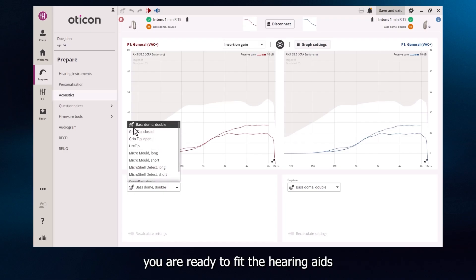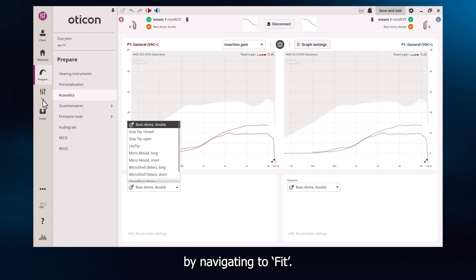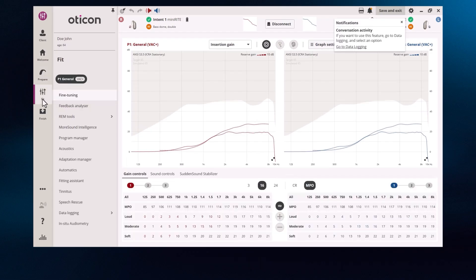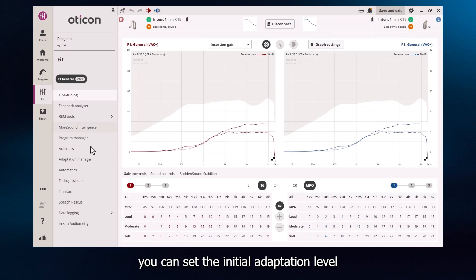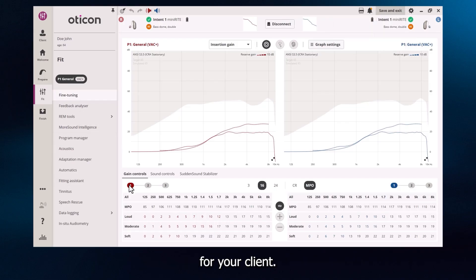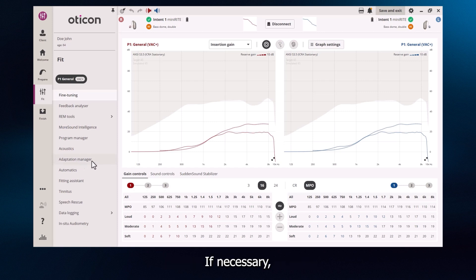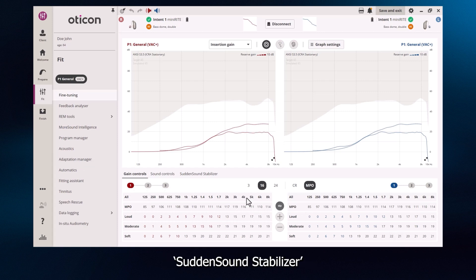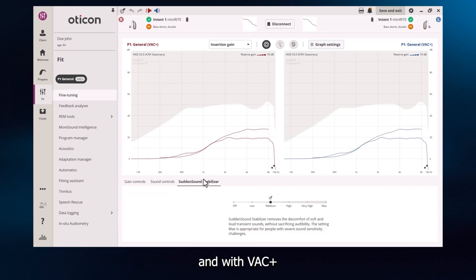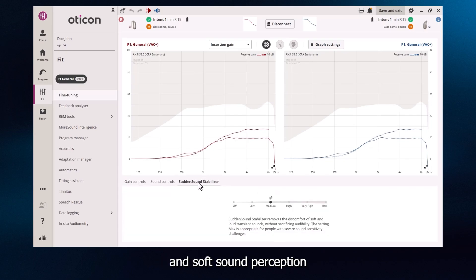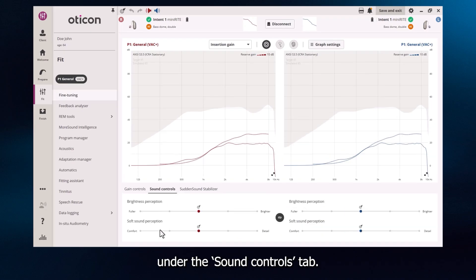After this, you are ready to fit the hearing aids by navigating to Fit. In the fine-tuning step, you can set the initial adaptation level for your client. Adjustments to adaptation time can be made in the Adaptation Manager screen. If necessary, you can also adjust the level of help provided by Sudden Sound Stabiliser, and, with VAC Plus as the selected fitting rationale, you can adjust the brightness and soft sound perception under the Sound Controls tab.